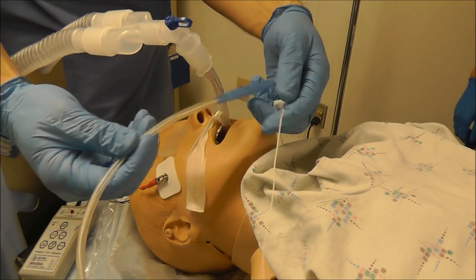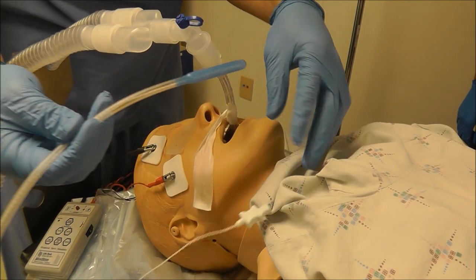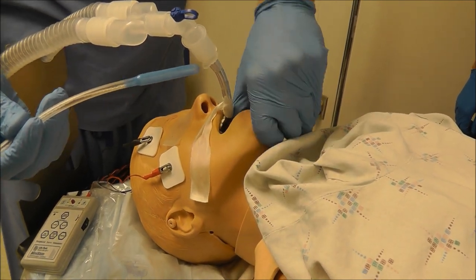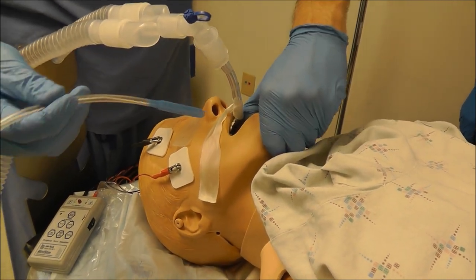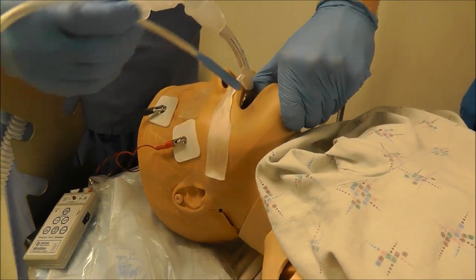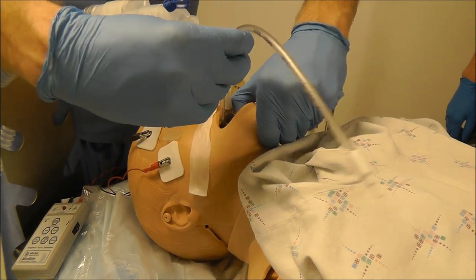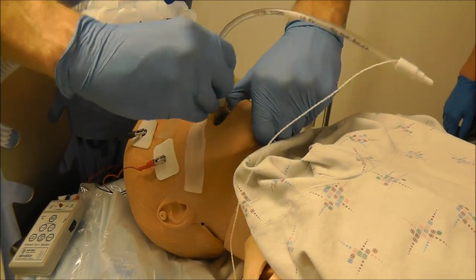If using an esophageal temperature probe, the way to do this is to grab the lower jaw and lift it up, and then advance it like so.